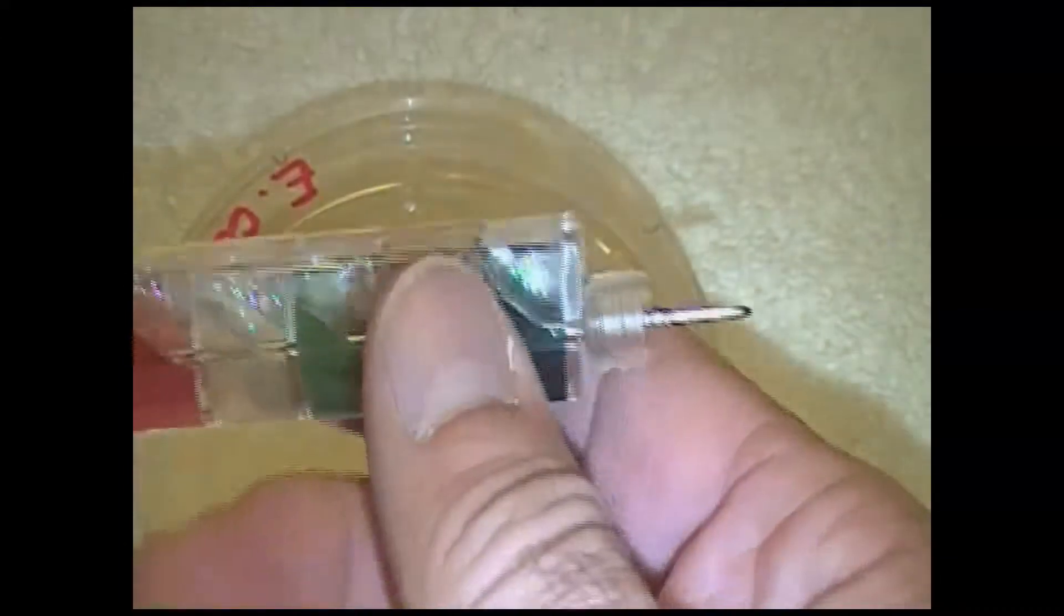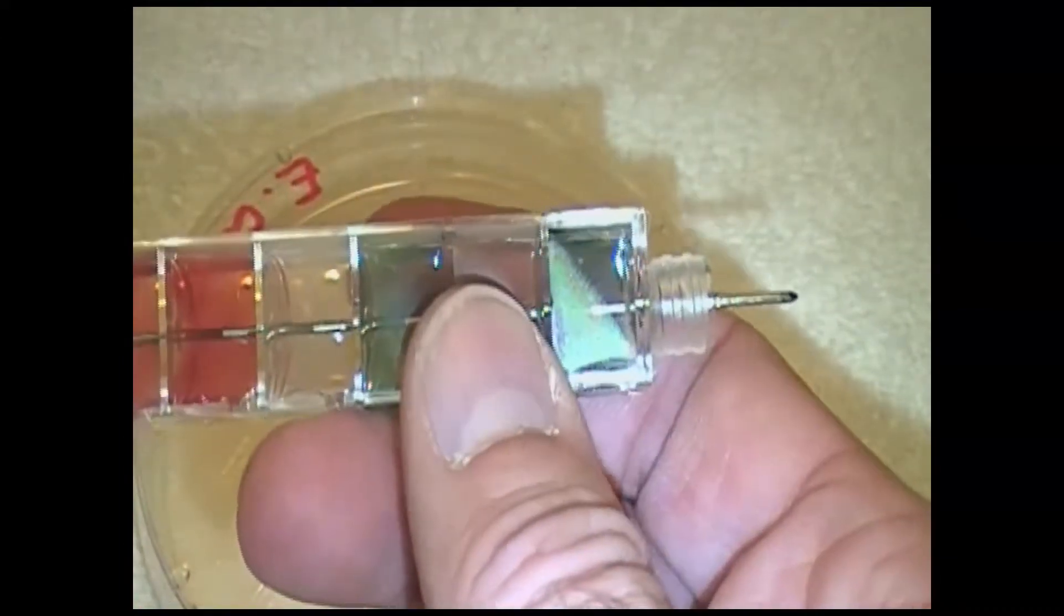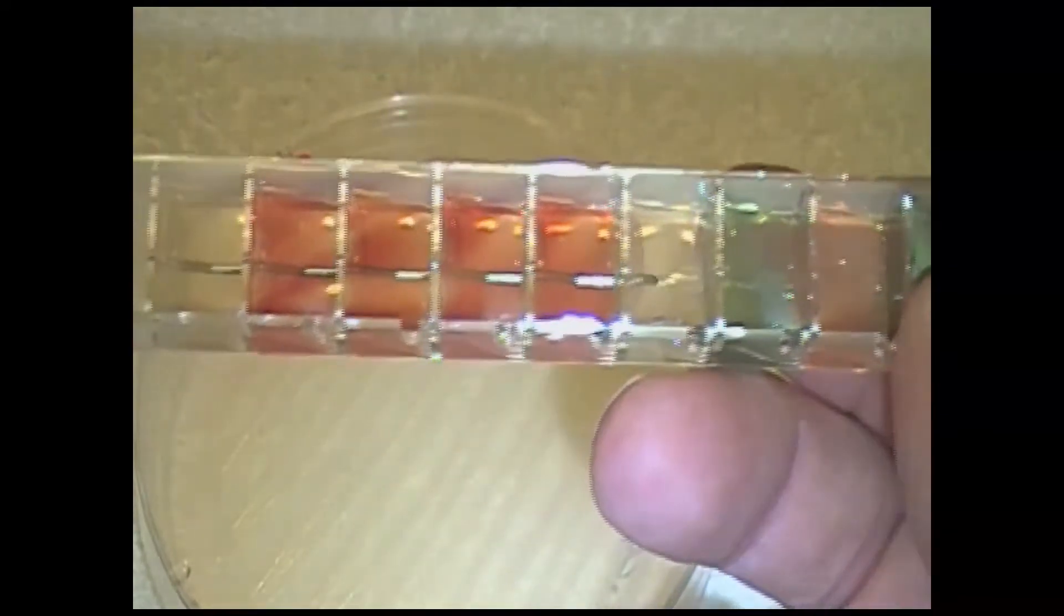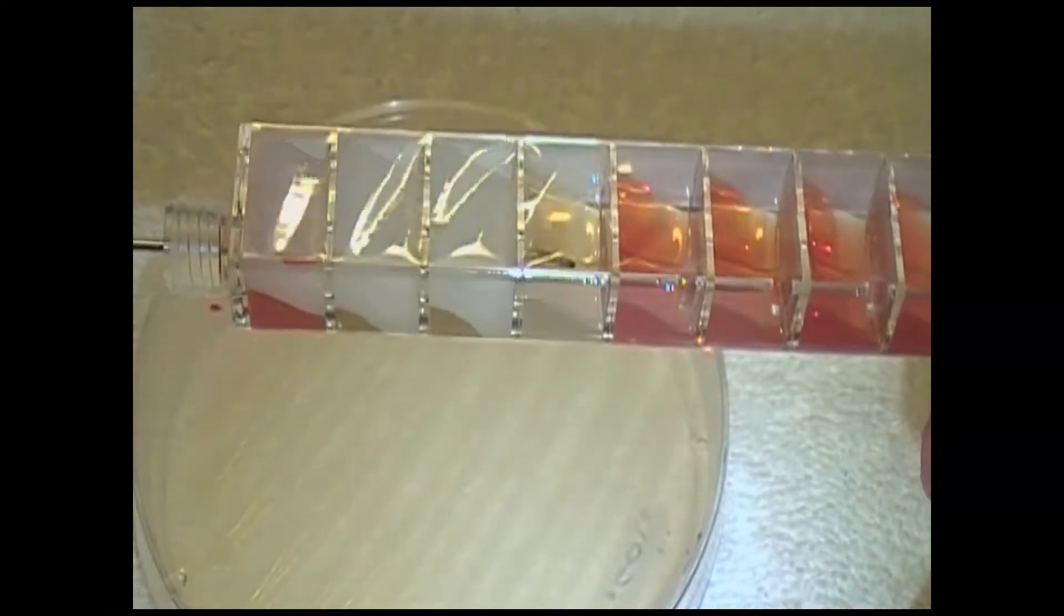We close the petri dish, and then we'll grab the handle over here. We are going to start to pull. As we pull, you will see the needle go through the center of the tube. You can see it going through the center of the tube. As it's doing that, it is inoculating the various compartments.